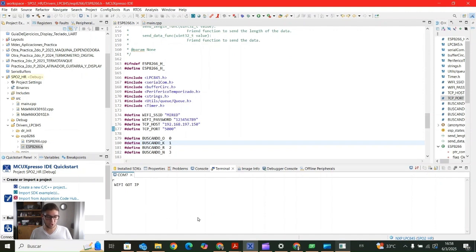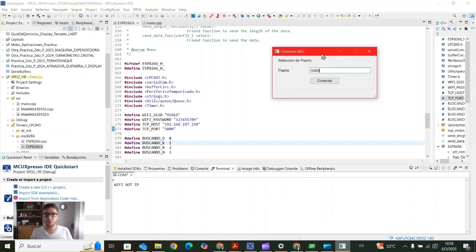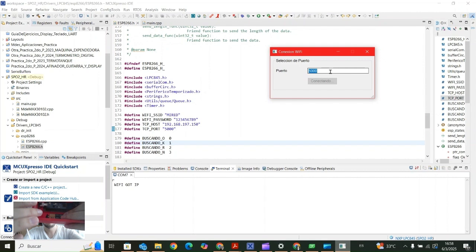We see a message here. Anyway, it doesn't matter because we are going to connect. Okay, click on connect on the user interface, and typically the connection should take a few seconds. If it takes more, you can always push the reset button. The reset button is this one that is black. It is small. I'm going to push it because it is not working.